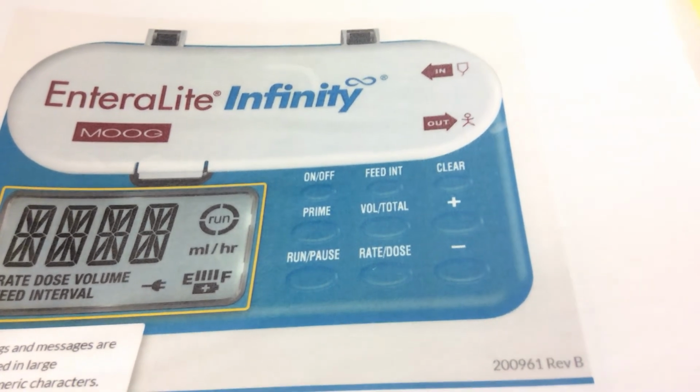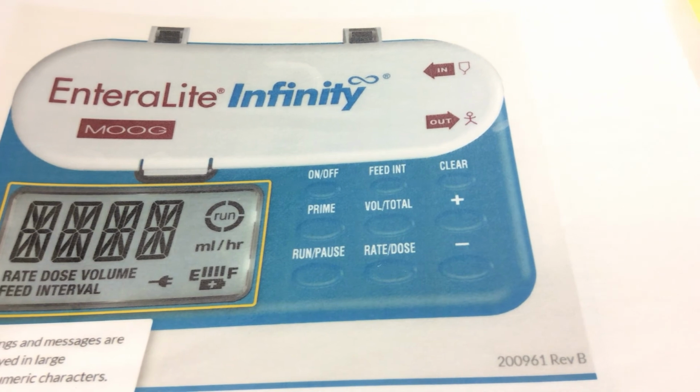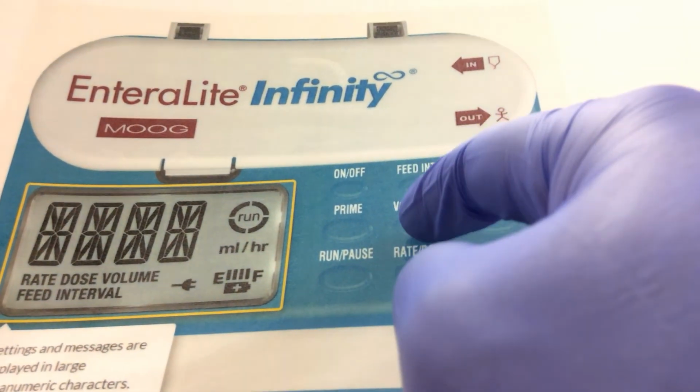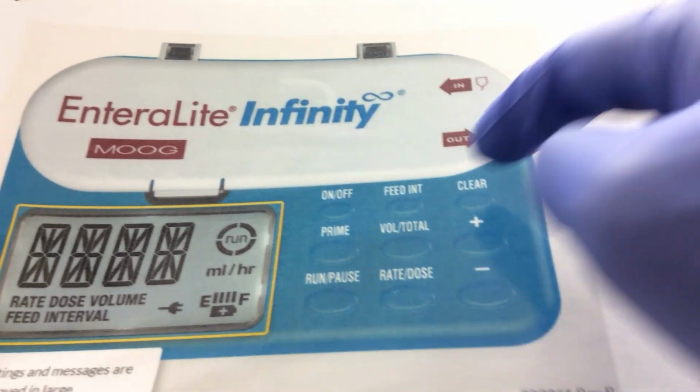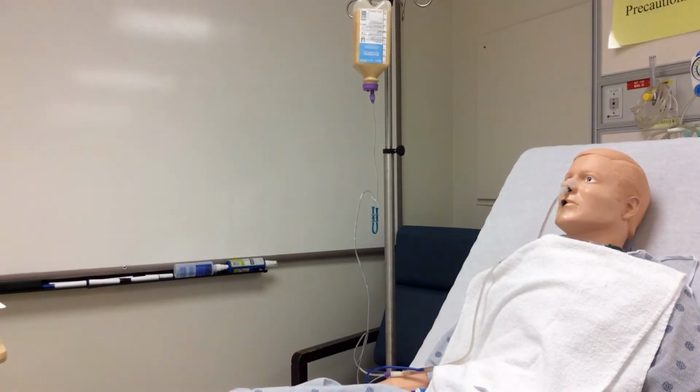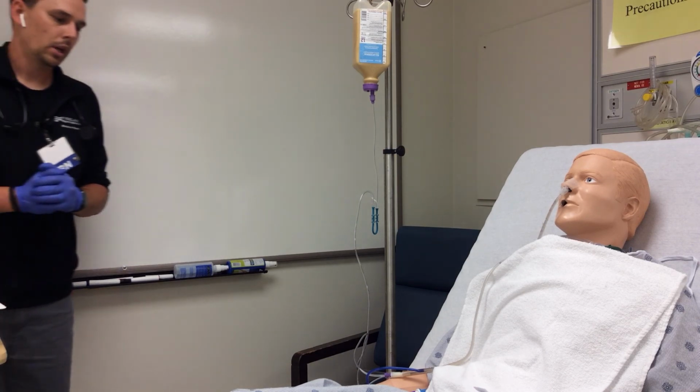Really the big things to know is that it primes, we press and hold, we can adjust the rate, and that it keeps track of that volume total and that we're clearing it out each time we're documenting intake for our patient. So again, we don't have one of these pumps available to us here at the school, but we will help you get comfortable with them over at main campus when we're there for clinical.